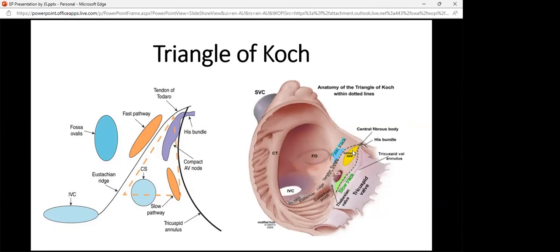It's a really nice one to do, just to throw in a bit of pacing as well. It's something that I teach everyone to do in the pacing clinic during a follow-up or even during an implant. When you're testing the RV lead, whether it's a threshold check or whatever it may be, just put the patient into VVI at, say, 90 and see if the patient has VA conduction. You're obviously not going to get the detail of the catheters like we do in an EP study, but you know whether the patient has VA conduction or not.